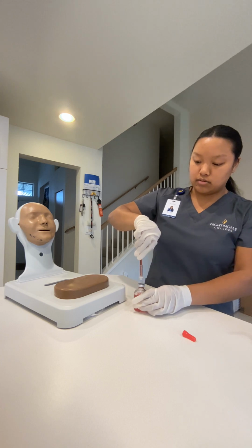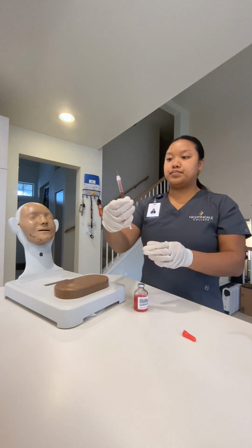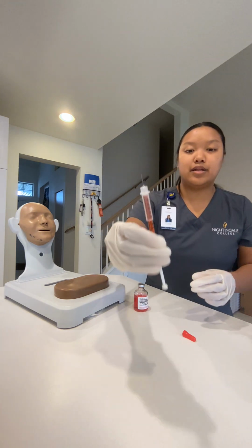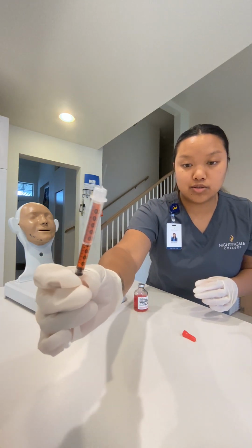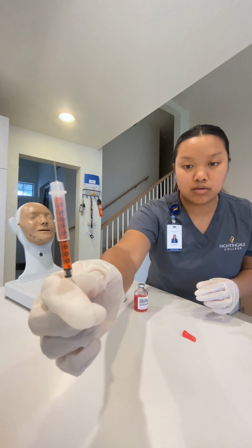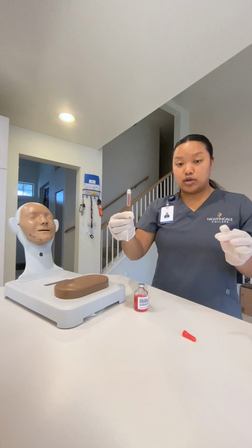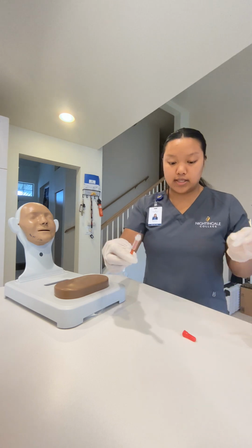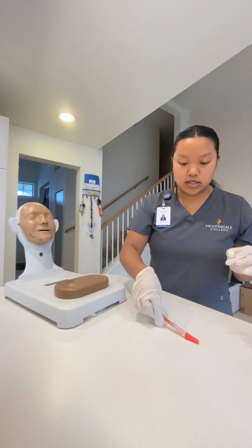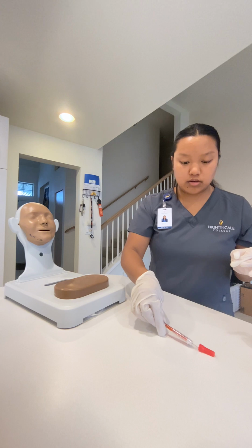I'm gonna pull it out. There you go. Now my 1 mL. There are no bubbles. And then I'm gonna go ahead and recap, and I'm gonna put this away because we don't need that anymore. Scoop method to recap, if I can get it on.